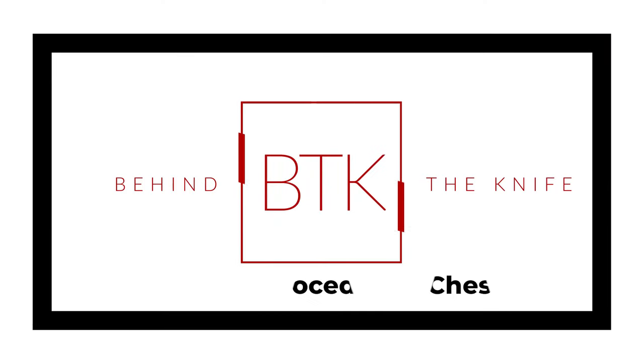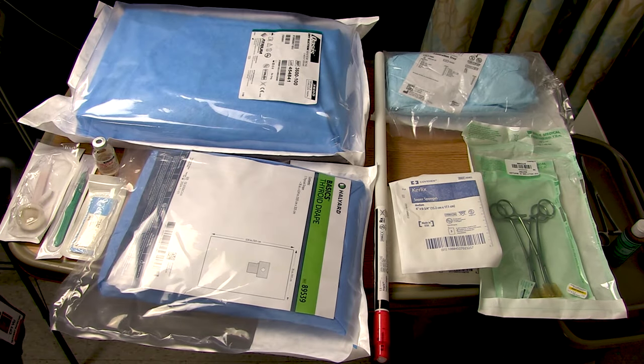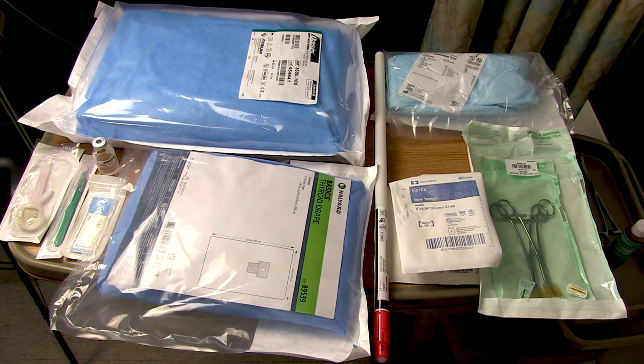This first episode is all about the humble chest tube. First things first, let's go shopping in the hospital supply room and get everything you could possibly need. I'll talk about the equipment now, but if you're short on time you can skip to the procedural steps in the playback bar below. In the room you should have a Mayo stand or similar surface to stage all your equipment on. Hopefully at minimum you grabbed a knife like this 15 blade and a chest tube — in an emergency situation that's actually all you need to get the thing in, plus your finger.